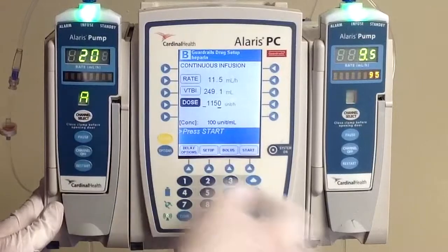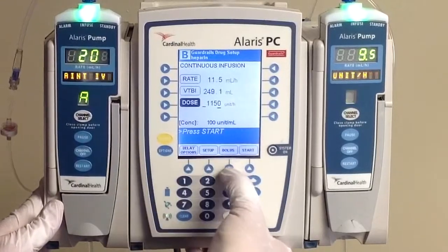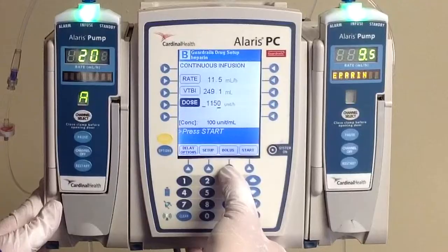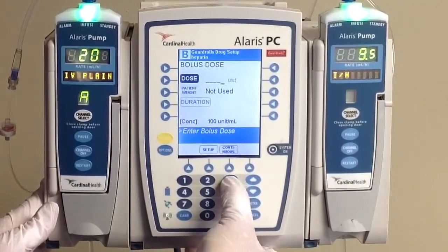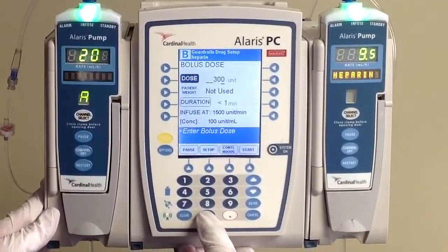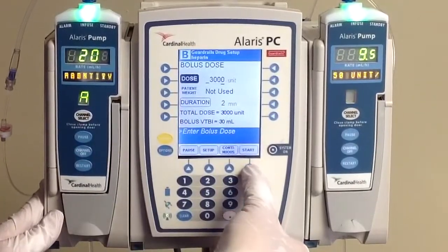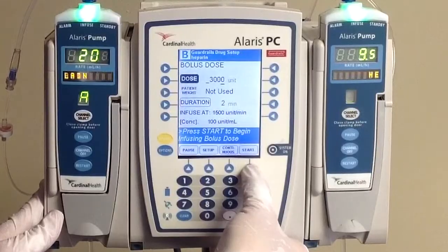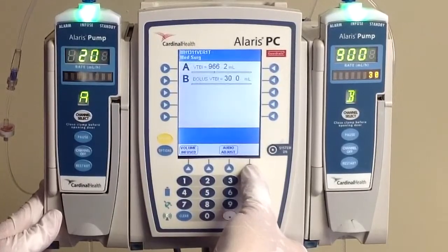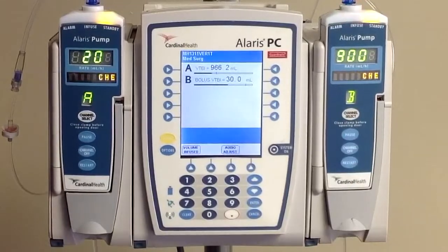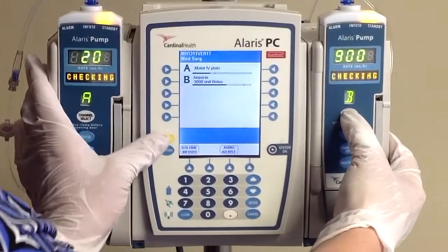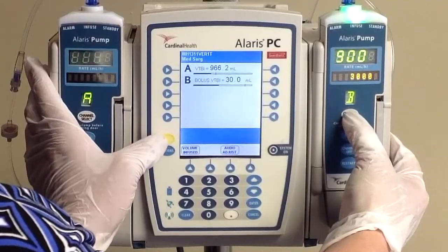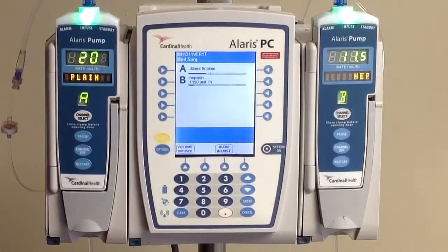Now our next step is to actually give the bolus, and we bolus from the bag so we don't have to open up our closed system. Click on the bolus button at the bottom of the screen and type in your bolus of 3,000 units. It's going to automatically calculate a duration for you. Go ahead and hit start to begin your bolus. Once it's done bolusing the 3,000 units, it is going to change right back over to our rate of 11.5 mLs per hour.